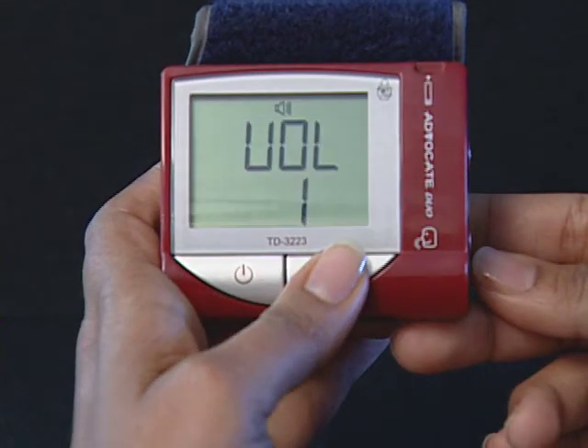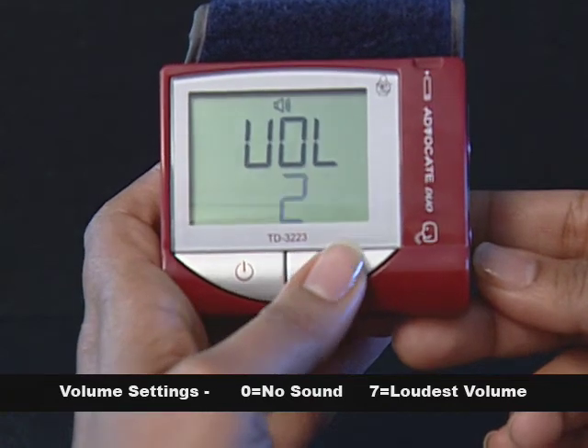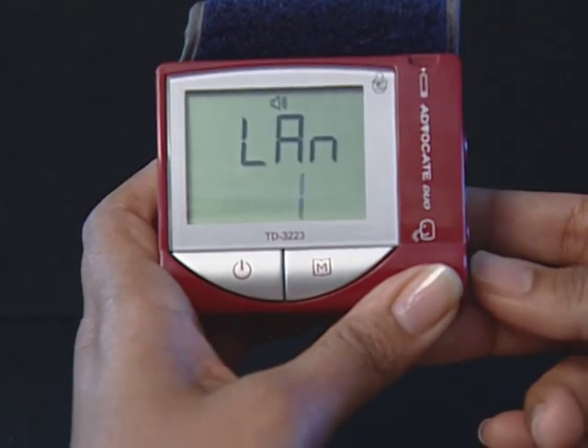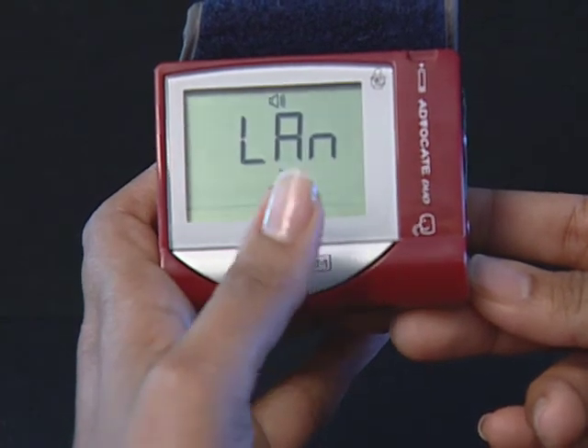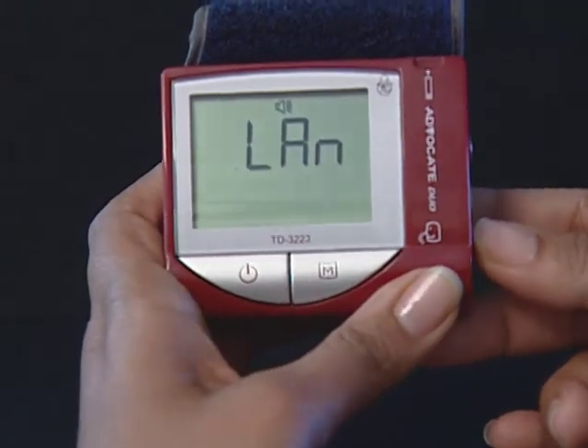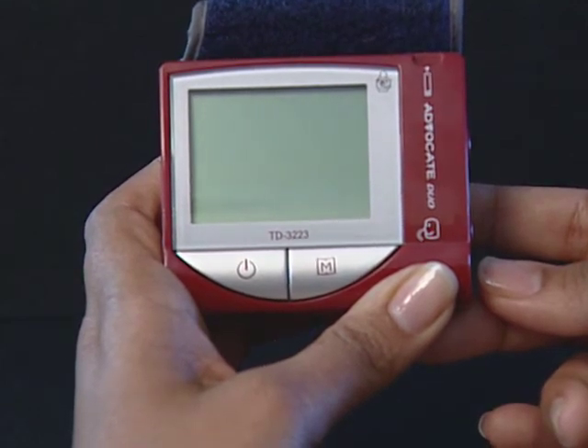Step 10: Select the speaking volume. The meter displays VOL, the volume symbol and a flashing number. Press the M button to select speaking volume from 0 to 7, where 0 is off and 7 is the loudest. Then press the set button to proceed to the next step. Select language: press the M button to select — L1 is for English and L2 is for Spanish. The setting mode is all completed. Press the set button to turn off the meter. Off is displayed before shutdown. Congratulations, you have finished setting your meter.